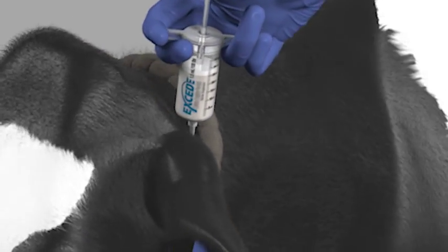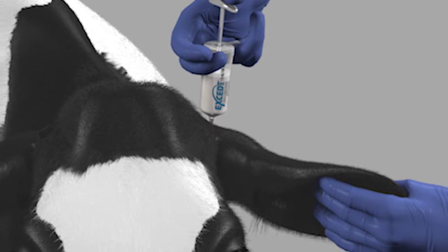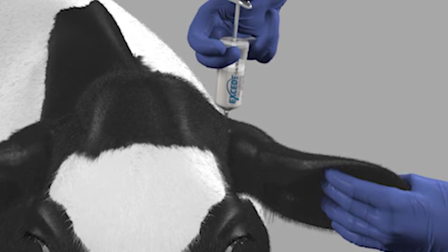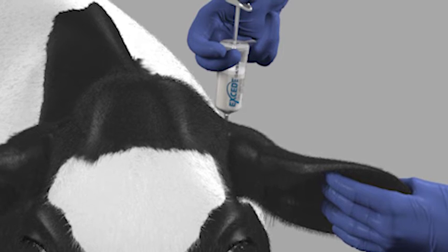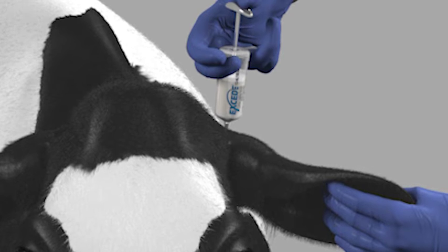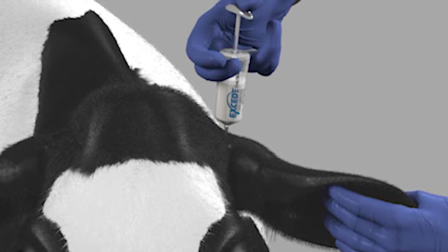To make sure your needle is in the loose subcutaneous tissue, pull back slightly on the syringe plunger. If you see a flash of blood in the syringe barrel, you may have hit a vein or artery. Remove or reposition the needle until you no longer see a flash of blood.